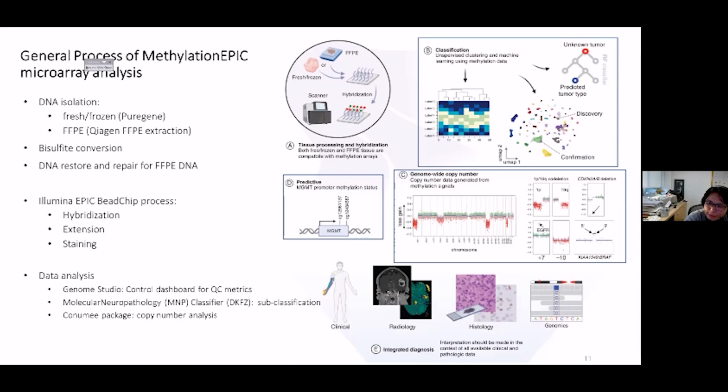The signal processing, methylation-based tumor classifier, and MGMT promoter methylation analysis were carried out for clustering and data visualization using the in-house tumor classifier software pipeline developed by the DKFZ and the German group. We were able to communicate with them and implemented this package in-house. For the calculation of the CNV, the methylated and unmethylated signal intensities are added together, and a ratio is formed against healthy reference samples that have a flat, normal genome. This copy number ratio is then plotted in a graph according to chromosome position. This is an R-based package used for copy number analysis.